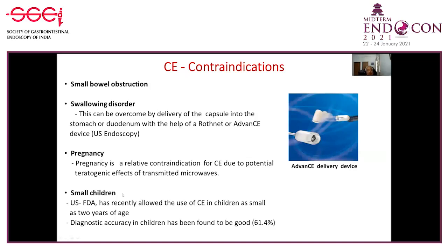What about small children? The US FDA has recently allowed use of capsule endoscopy in children as small as 2 years of age. The diagnostic accuracy is about 61.4%.